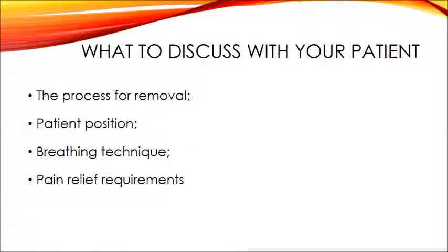When discussing the removal of your patient's chest drain, you'll need to review with them the process for removal, the position you want them to be in for the removal, and the breathing technique that you want them to use. Chest drains should be removed with full lung expansion to reduce the amount of residual air in the chest cavity and to prevent pneumothorax from reoccurring. And you'll need to discuss if they have any pain relief needs. Your patients will want to know how much pain they will have and how long it will last. So let's watch one in real time.